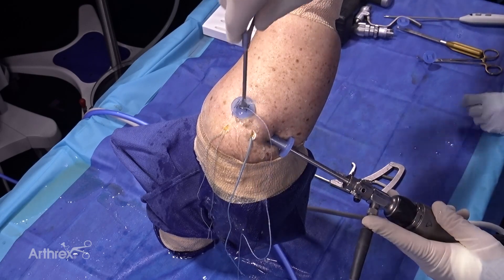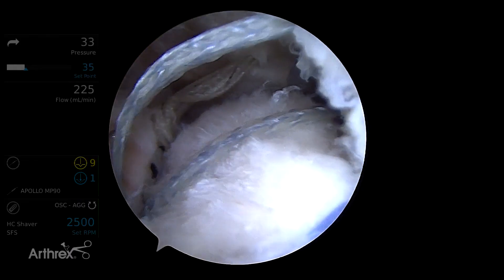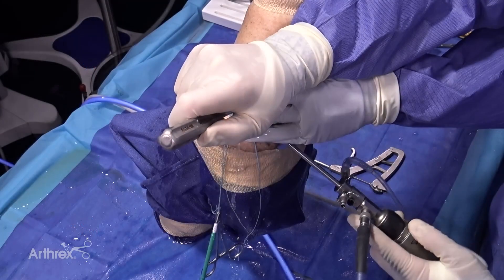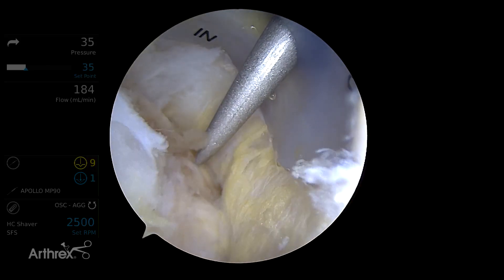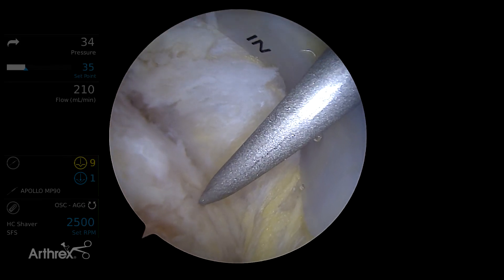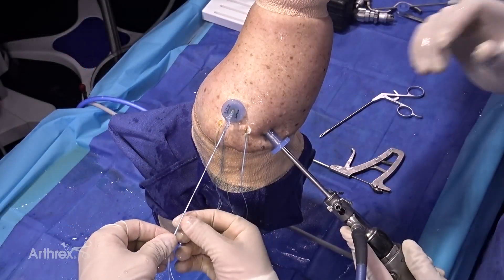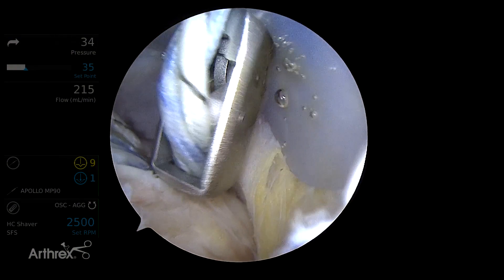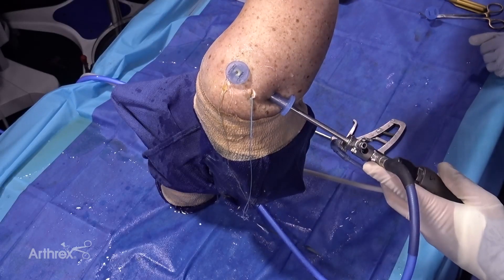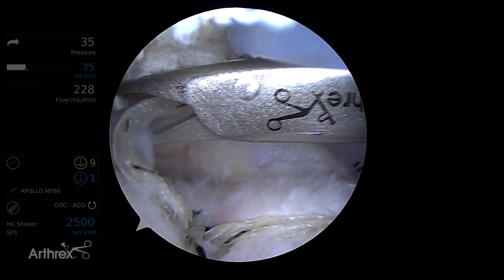Along with that cinch loop we're going to bring a tape from our posterior anchor and a tape from our anterior anchor. We're going to pick a spot on the lateral metaphyseal part of the greater tuberosity and internally rotate slightly. This is a standard swivel lock — not the knotless swivel lock. We won't need that safety stitch so we'll take it out, and now we can cut the ends of these tapes and the end of the cinch loop. Now we'll take out our remaining tapes and I'm going to show you how to reduce the dog ear after that lateral anchor is in place — we'll take out one tape from each anchor.